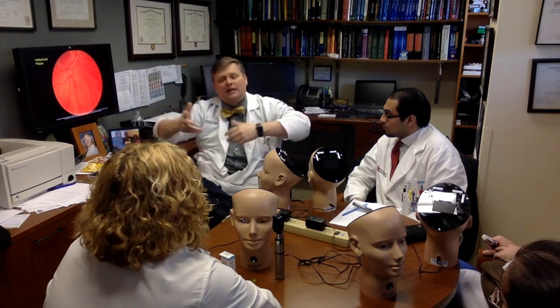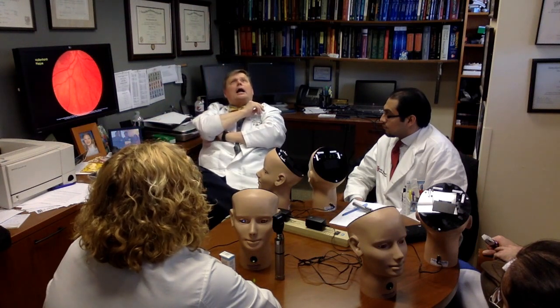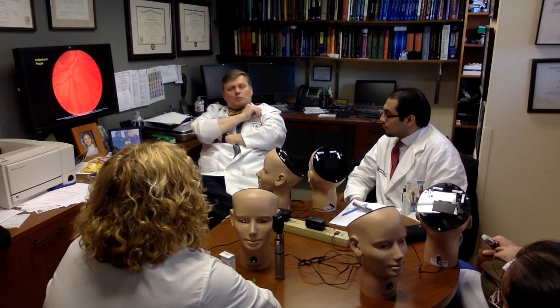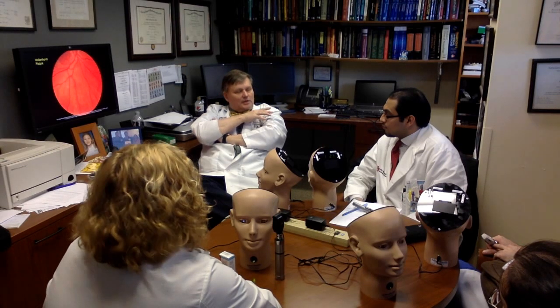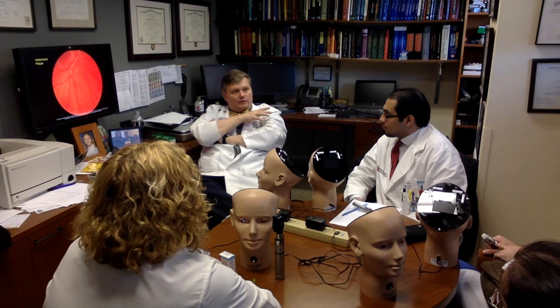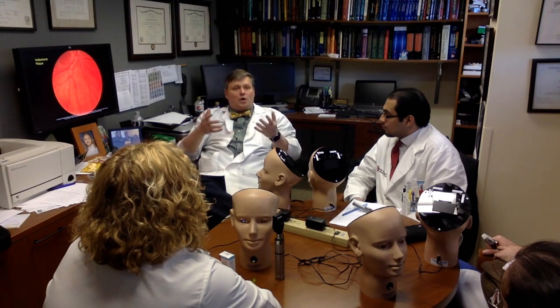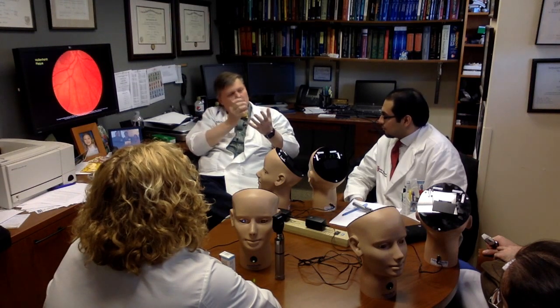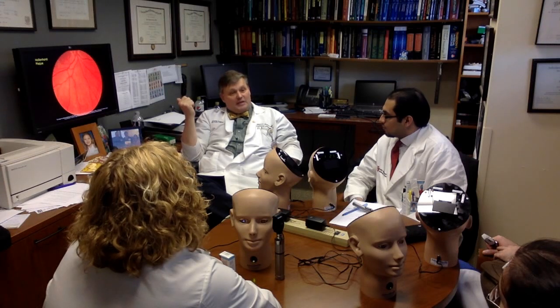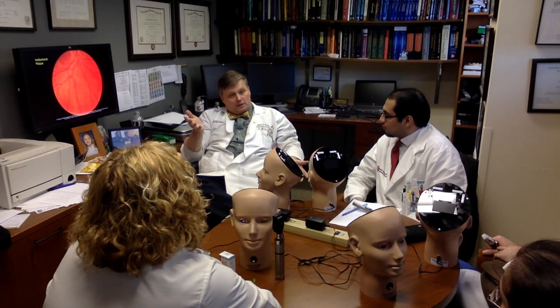Now, are there going to be lots of ophthalmological things that are normal variants that we're not going to recognize? That's fine, and we'll call the ophthalmologist. So you look at some weird thing, you go, I don't know what the hell that is, and the ophthalmologist says, oh, it's a tilted disc. You know what I mean? The optic nerve is coming in and it's tilted. Okay, fine. There's all types of weird anomalies. But these major things you want to be able to recognize.